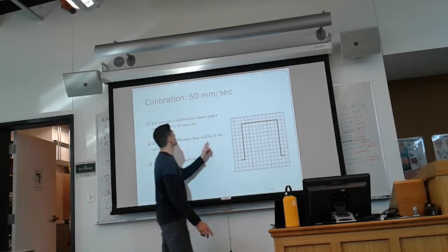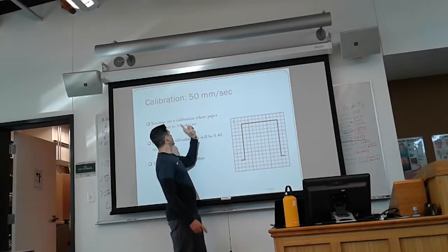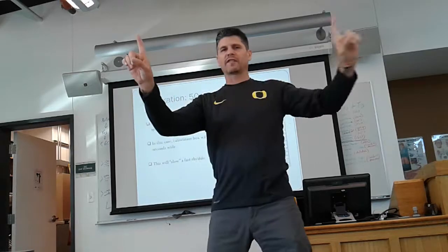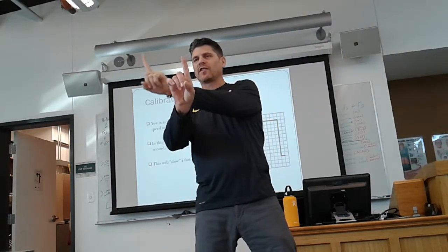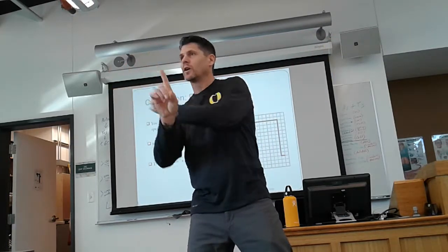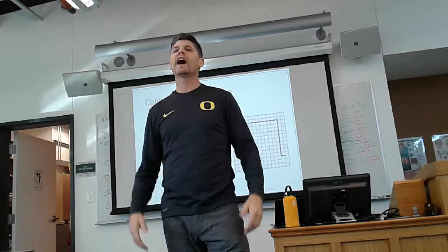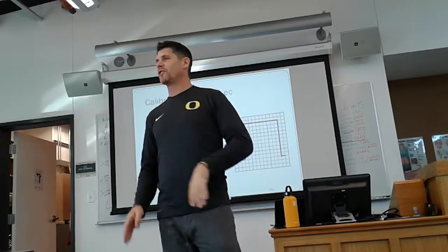Okay? Conversely, we might have a time where we calibrate it to have the paper run twice as fast under the pin. If the paper is running twice as fast, so if this is the speed that it's normally going, this is my pin, and the paper is running this fast under the pin, if we speed up the paper, what's it going to do to the rhythm, to the ink that's on the paper? Yeah, it's going to widen it out. It's going to slow down the ink overall by speeding up the paper under that pin.